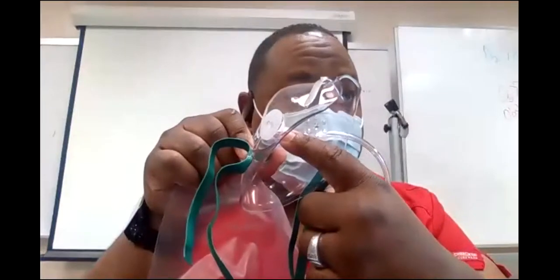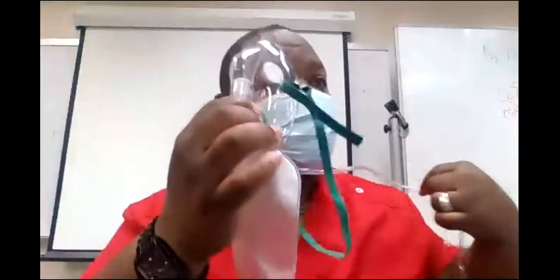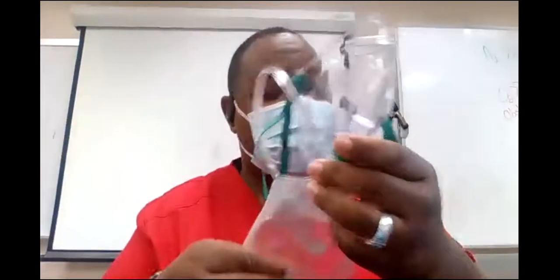Now, there's a trick to the non-rebreather, because when you get it, they usually take one of these off. It's still a non-rebreather because it has this valve here, okay? But the reason they do that is because what if it becomes disconnected from the oxygen and you didn't know it? And the mask is sealed on the patient's face. When he tries to inhale, if you have this on there, he can't inhale anymore. There's no more oxygen. The bag is flat because it came loose, right? You didn't know, you were busy. It came loose, or he pulled it off, or somebody did something.